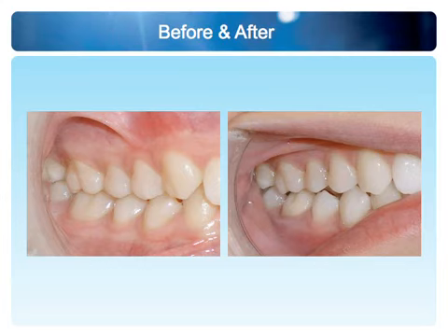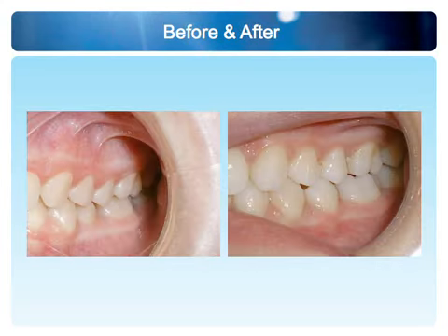Right side class 1. This needs a little time to settle, and as you're wearing retainers like Vivera overnight, it gives us a chance to settle. And as it does, we would change the retainer once it's in a better place. Here again, class 1 occlusion. We've established the canine and molar position, and everything is lined up very nicely, no interferences.